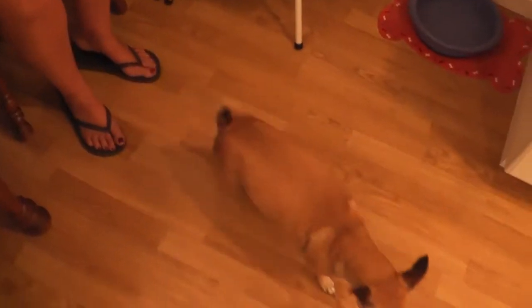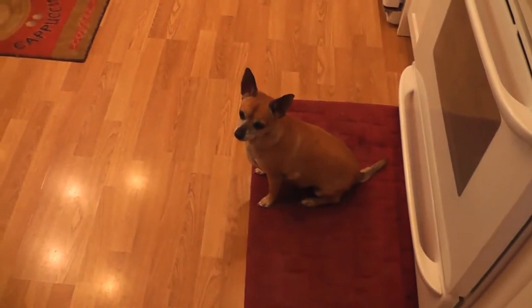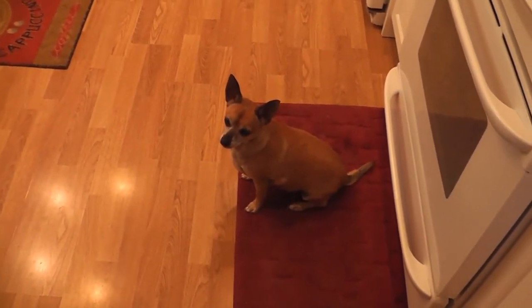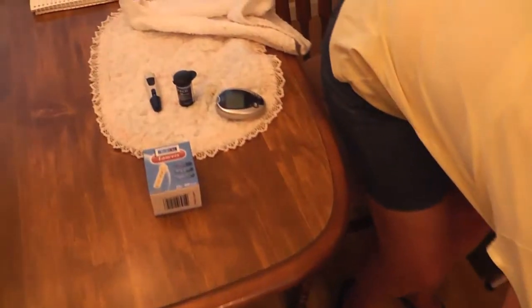And there we go, all done! Good girl. Now she thinks she's going to get another treat. Can you sit pretty, Tigger? Sit pretty. That's a good girl — very good.